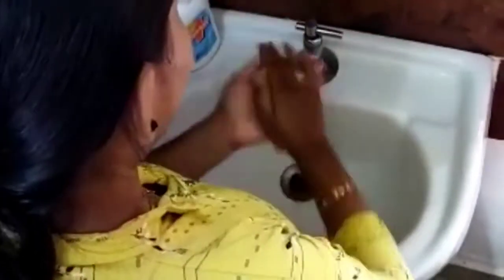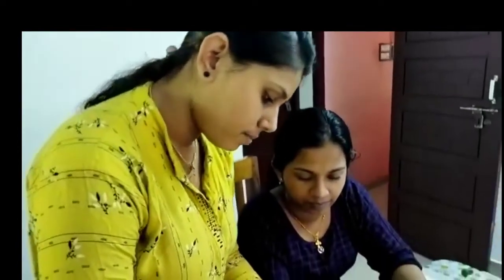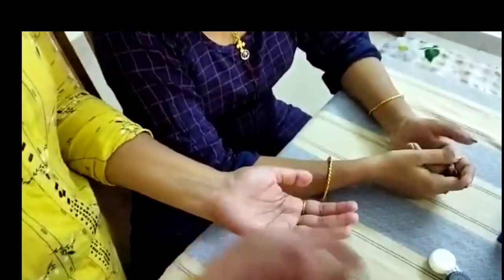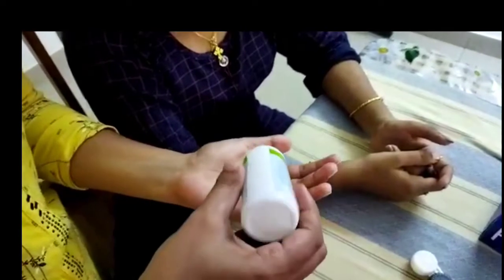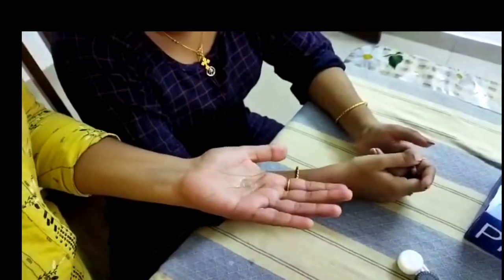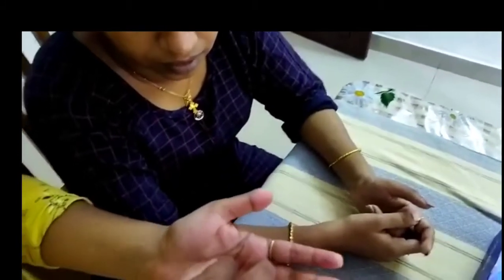First one is washing. We should wash our hands thoroughly with soap and water, then rinse well and dry with a lint-free towel. While the lens is positioned in the palm of our hand, pour saline solution onto the lens and rub the lens well for 5 to 10 seconds smoothly. Then pour off the excess solution.